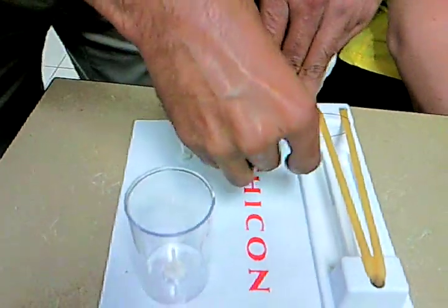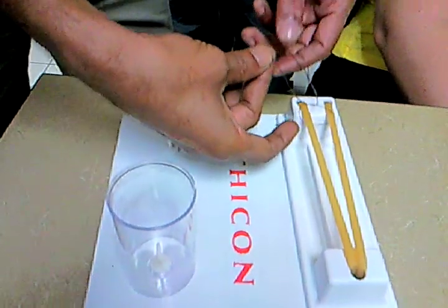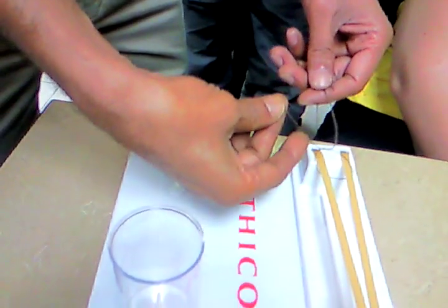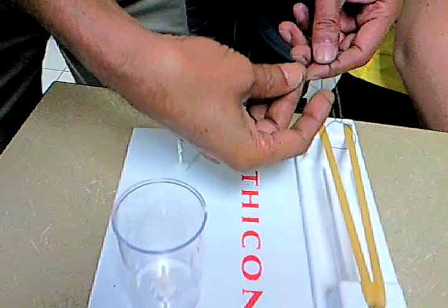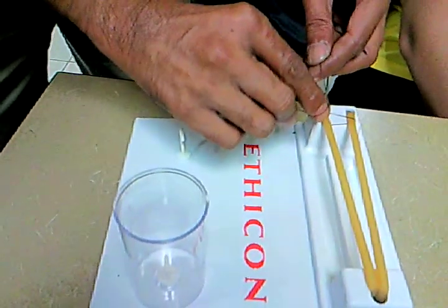First turn, hold this end. Now I'm using it again. The only thing is I'm holding it between my middle finger and my index finger as a lever, and I'm just turning it and bringing the small end.